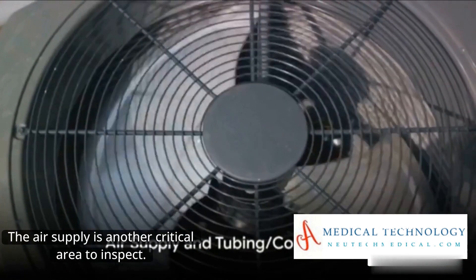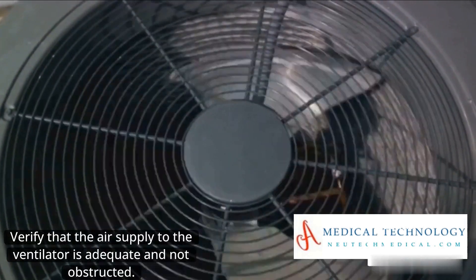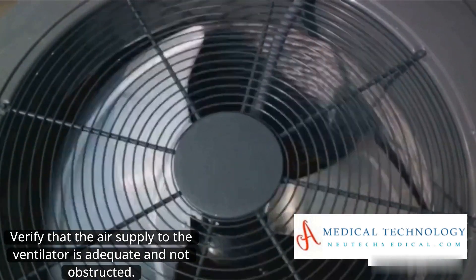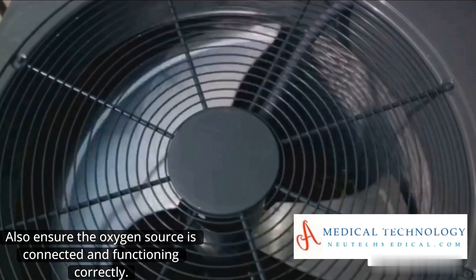The air supply is another critical area to inspect. Verify that the air supply to the ventilator is adequate and not obstructed. Also, ensure the oxygen source is connected and functioning correctly.